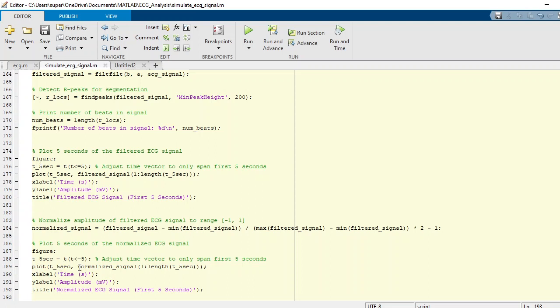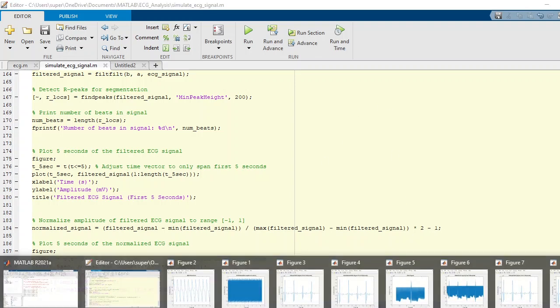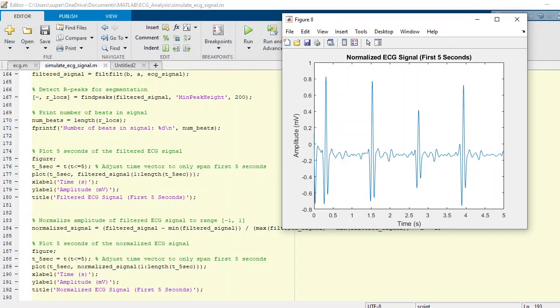That will plot a normalized signal, and you will see a normalized signal like this. Now the data is minus one to one.